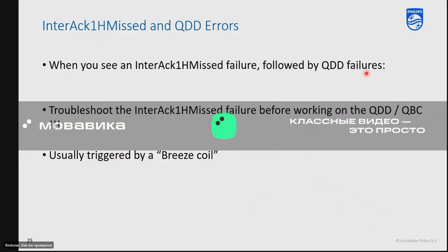Hey, one question, Dale. When you said that if you have a loose connector or something and you mentioned earlier to replace it, do you mean to replace the whole cable, that internal cable connector, or just blow the air, clean it, and then replug it? Well, internally, you would just blow out and reconnect it. Exactly. Yes. That's a separate project from doing an FRU for a cable, which you would replace the external cable that goes into the interior of the coil.